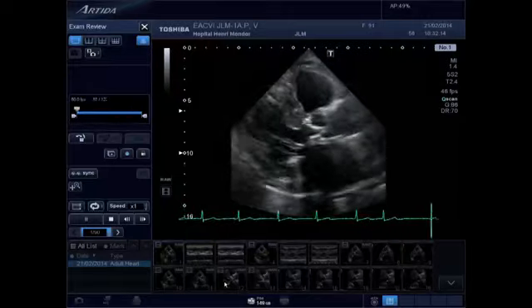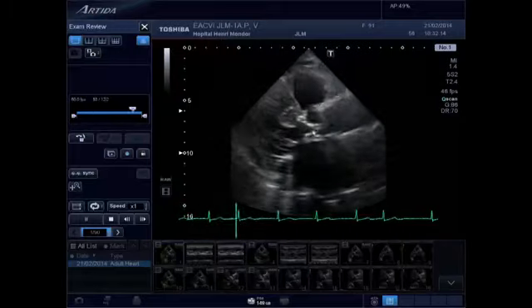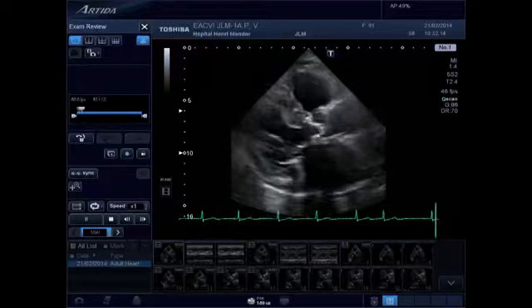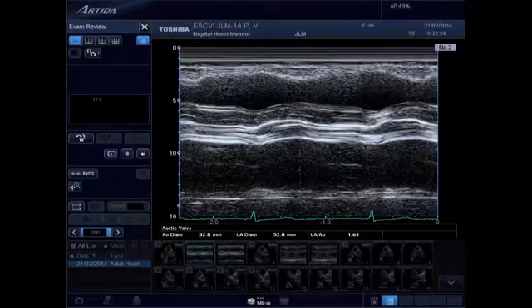And here, the first view on the parasternal long axis shows that the aortic valve is calcified and with also a calcification of the left ventricular outflow tract and a very limited opening of the valve. We still perform the M-mode measurements that confirm that there are heavy calcification within the aorta and with the diameter of the valsalva sinuses at 32 millimeters, which is normal, and a mildly dilated left atrium at 52 millimeters of diameter.